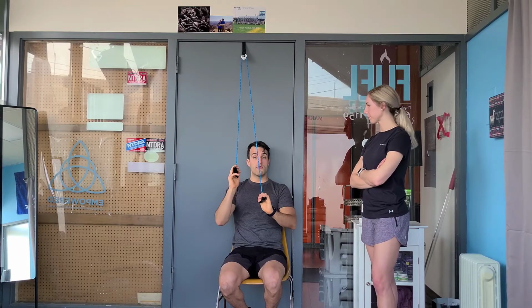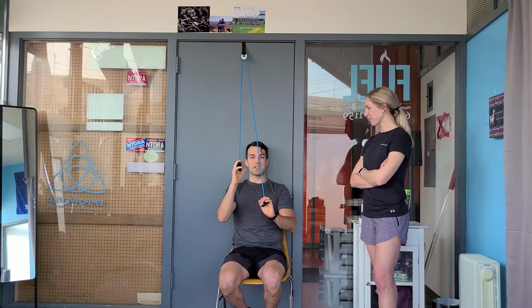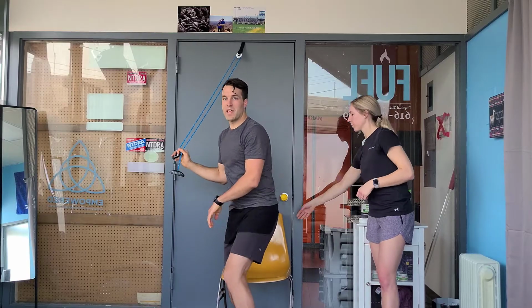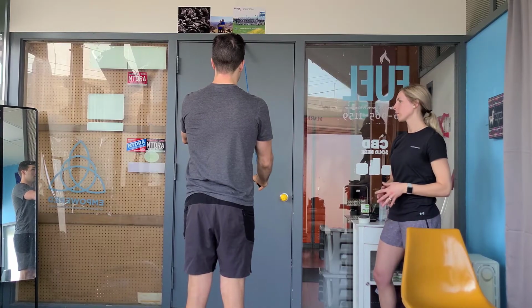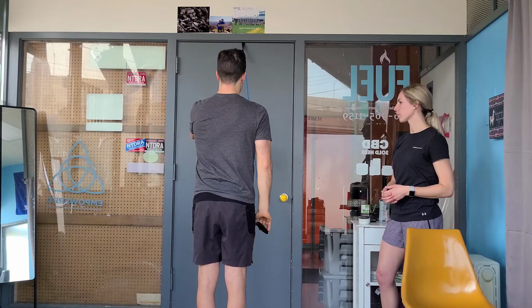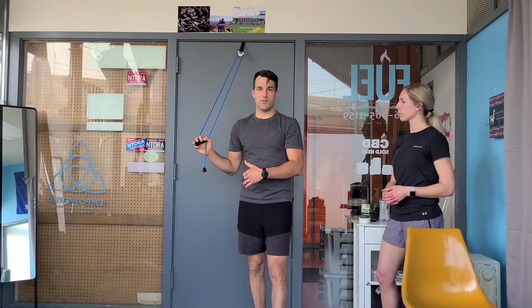So you can do it facing or with the seat against the door, just like this. The other way to do it is in standing. I'll face the pulley just like so, and do that same thing and pull. So just like this. And you could do either way. Either way works just fine.